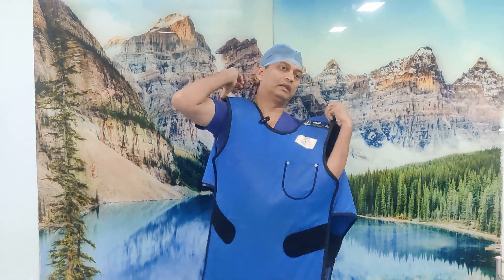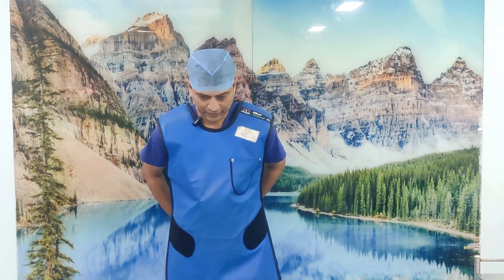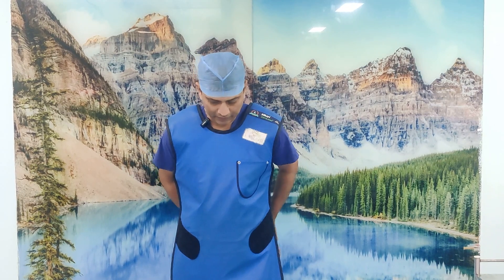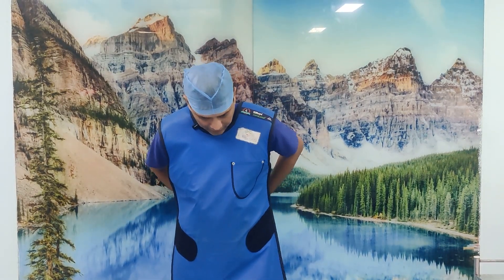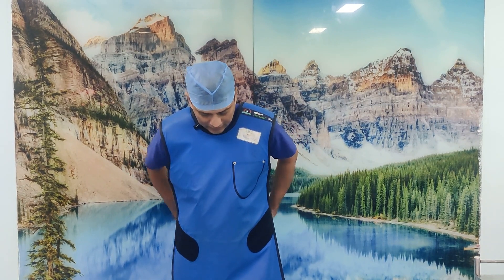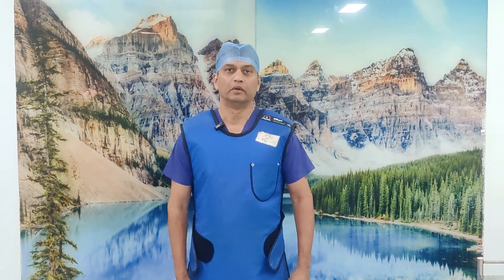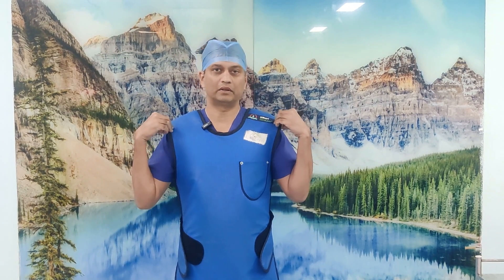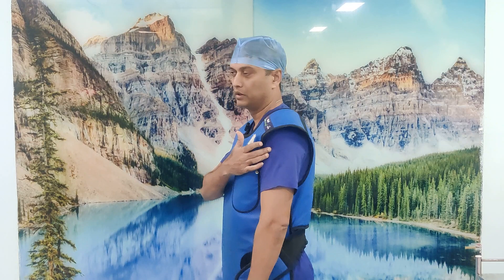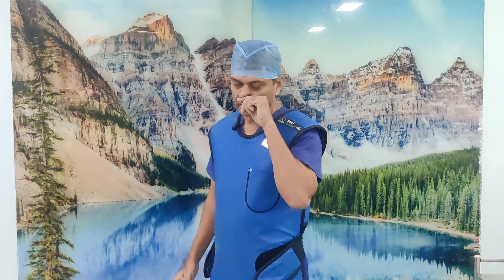So what most of us will do is we will do this - strap it across - and that is our wearing of the lead apron complete. Now when you wear an apron like this, the whole weight of the lead apron is coming onto your shoulder. Because of its weight, it drags down, and as time progresses, you can feel tired.